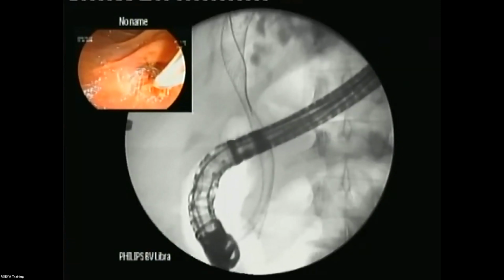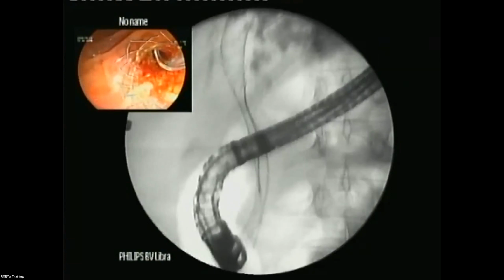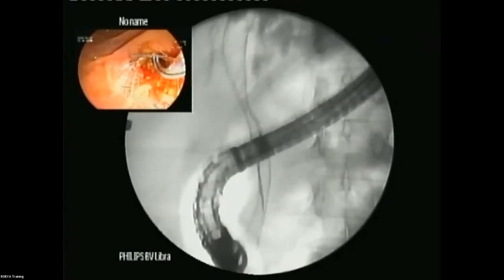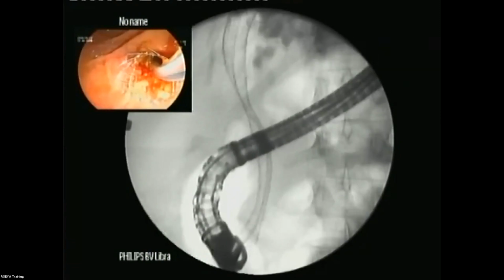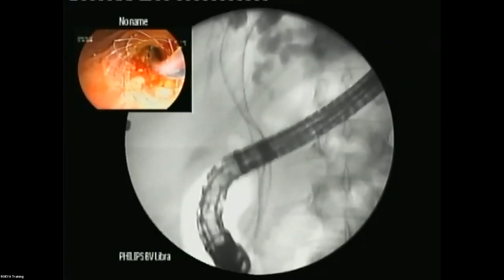Hani said that, which is a good question. If you like to go through the stent, you should know another type of stent, and you are right, Hani, Professor Khalid. But we'll give him a few minutes. But this is a good drainage of the left side, and maybe the only one we have.